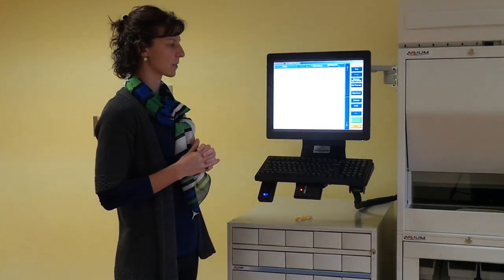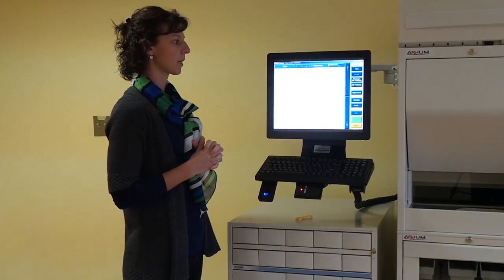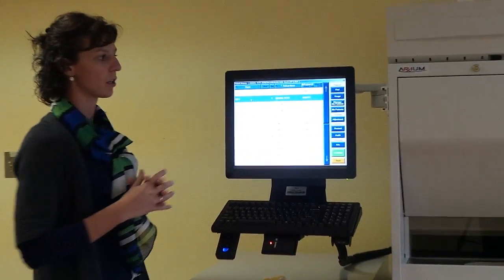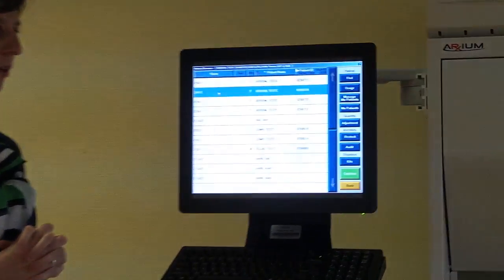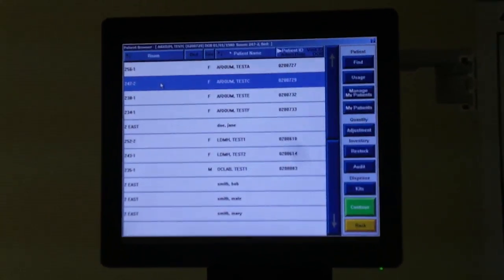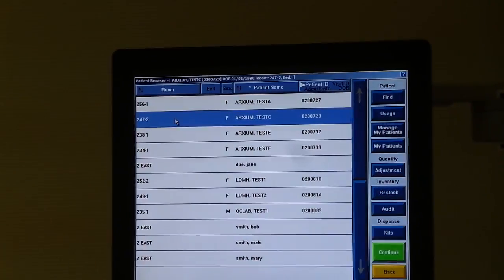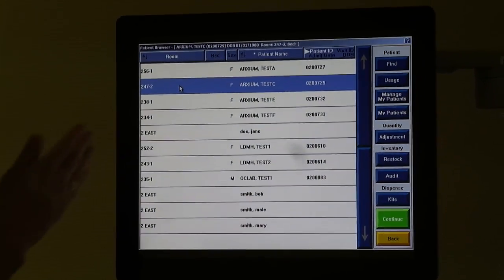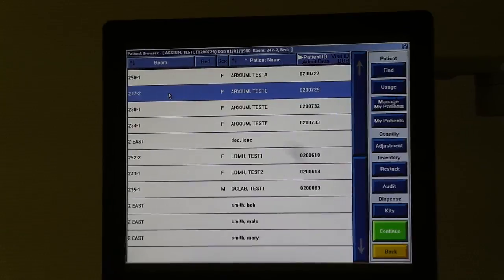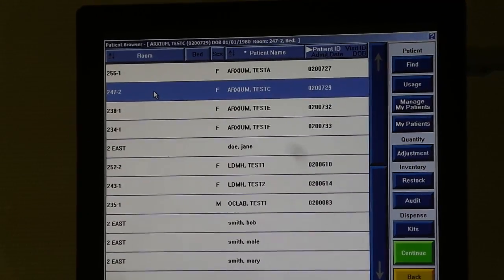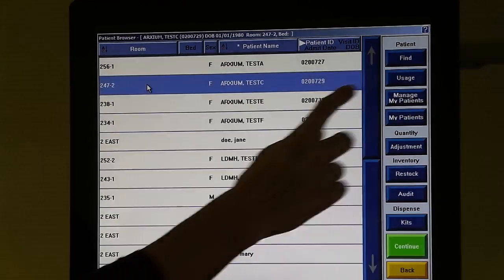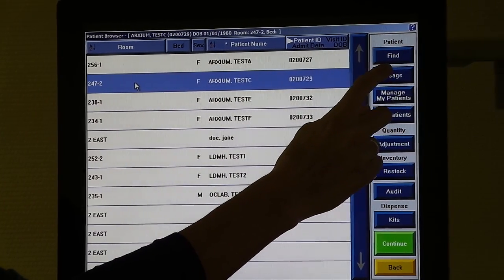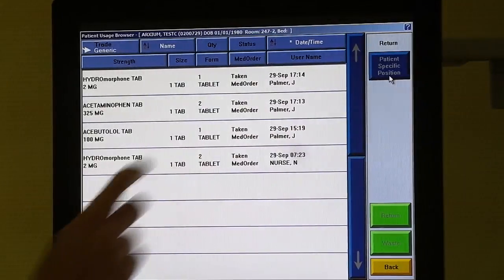To begin this process, simply select the patient for which you wish to view their usage. Touch the screen to select your patient and the information will then be highlighted in blue. Hit usage from the right toolbar.